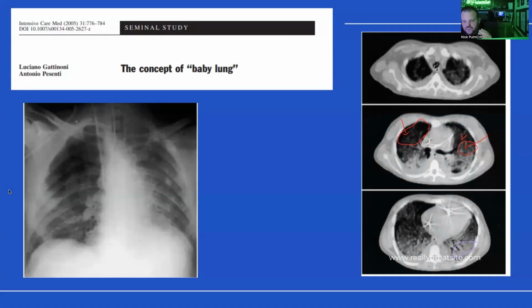then they said that this lung is recruitable. Because I think now, and you could certainly disagree or have different experience, but when we talk about recruitability, me personally, I don't really know if I can point my finger and say this person is recruitable or this person is not recruitable. That's a harder thing to flesh out.